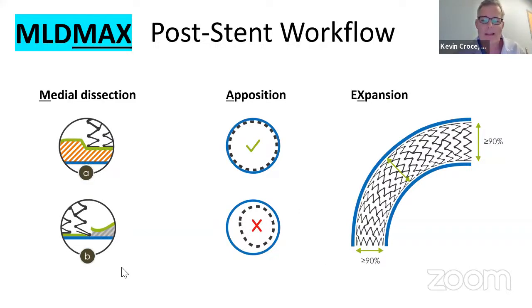And I think the holy grail of outcomes is understanding the stents are well expanded, hoping to get 90%, but at least 80% expansion with the minimal stent area, holding the artery open to approximately 90% of the reference area, proximal and distal. This is an important point of knowing whether your stents are well placed to understand what your expansion is. And this is easy to do by IVUS and by OCT, either manually or some of the newer systems are able to do this automatically for you.